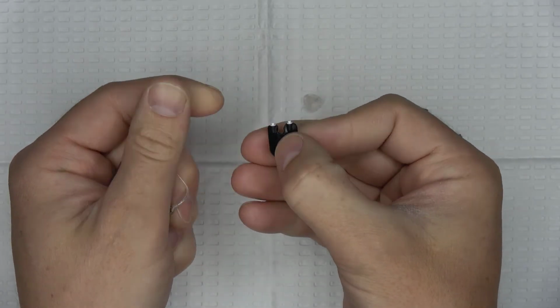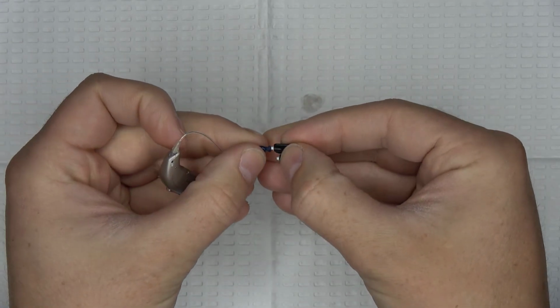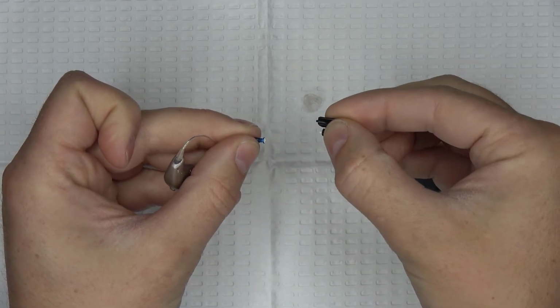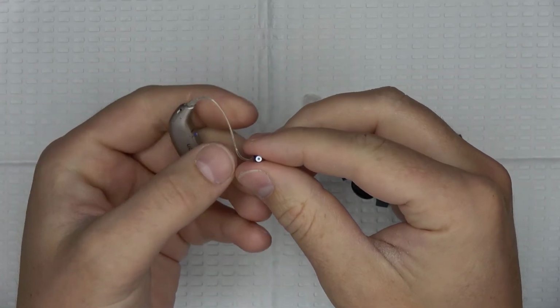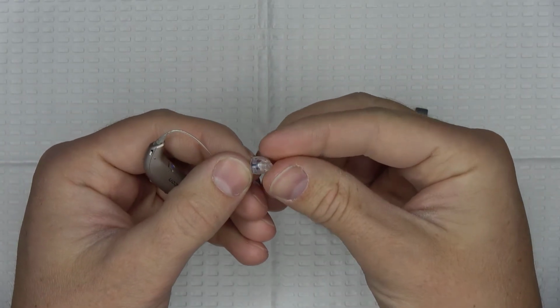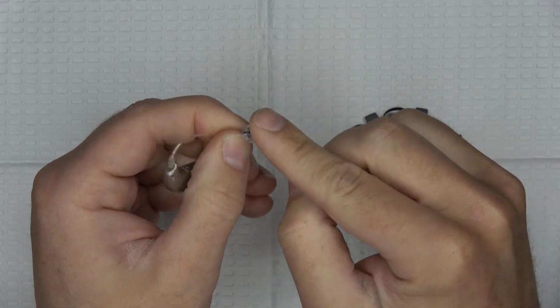Once you confirm which side holds the new wax guard, insert it into the opening of the receiver by gently pushing. Once you have inserted the new wax guard onto the tip of the receiver, simply pull the pick away from the receiver, and now you can discard the pick. To finish the process, simply install the rubber dome back onto the tip of the receiver and press down on the tip of the receiver to ensure that the dome is completely seated onto the receiver.